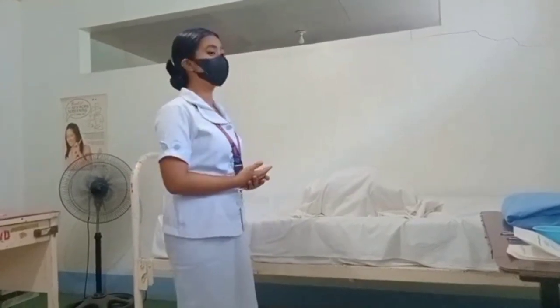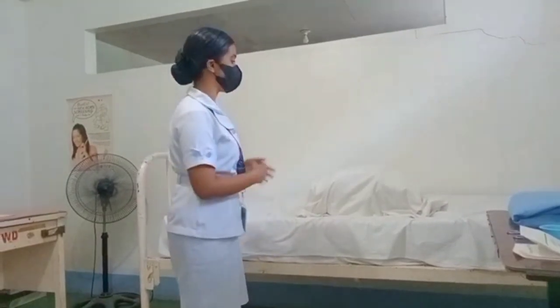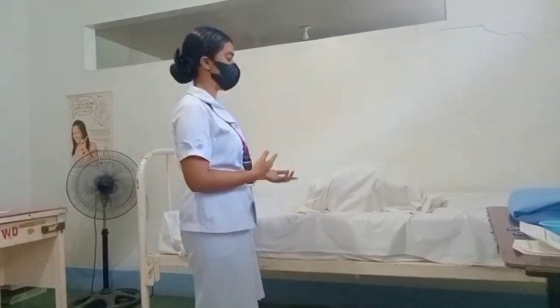Okay, next is I'm going to check the doctor's order. I'm going to determine if the procedure is straight or indwelling catheterization. So the catheterization that I'm going to use is a Foley catheter. And I'm going to assess if the client needs a collection of specimen. So, we don't need to collect a specimen.